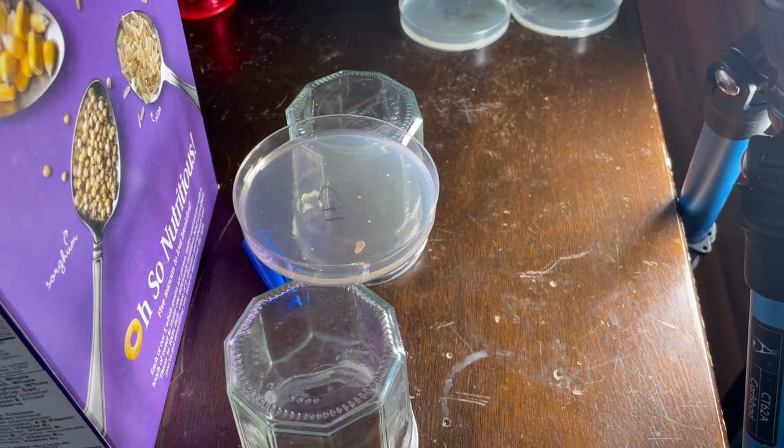The results are super clear, but I have to admit, they're visually underwhelming because there wasn't a tremendous amount of bacterial growth on any of the triplicates to begin with. But there is a stark difference, and I think using the right lighting techniques, I'll be able to highlight that difference between the triplicates. This is the first control.